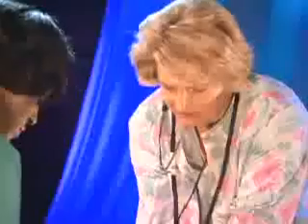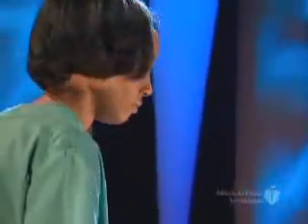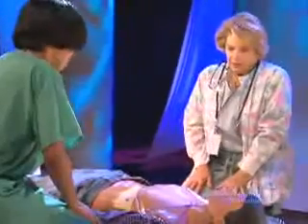Most AEDs begin to check the rhythm as soon as the pads are attached and connected. For others, you press an Analyze button. Analyzing heart rhythm. If the AED finds a heart rhythm that could be treated with a shock, the AED will tell you so. Shock advised. Stay clear of patient.